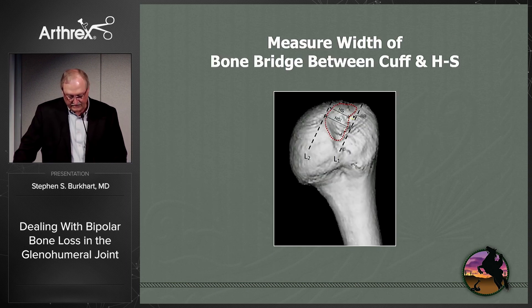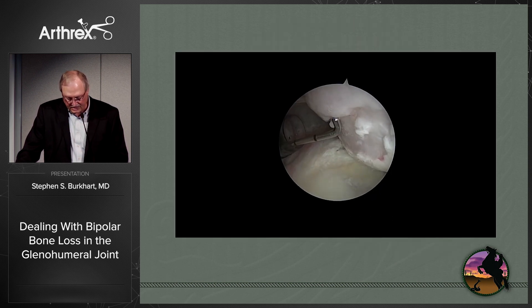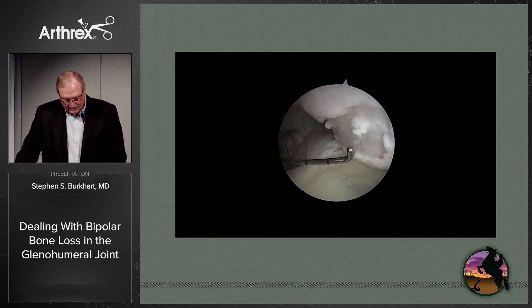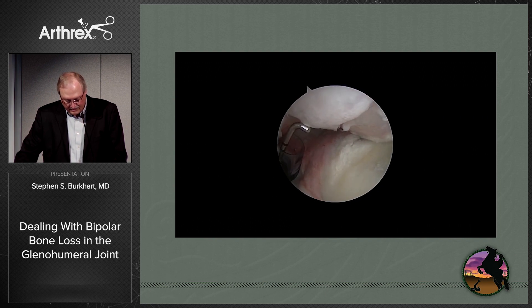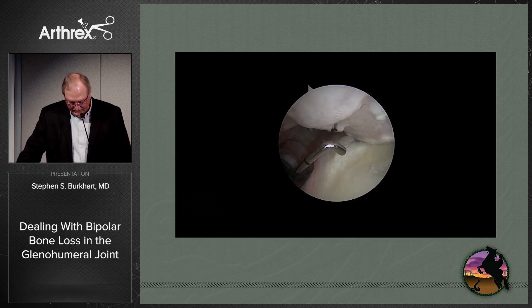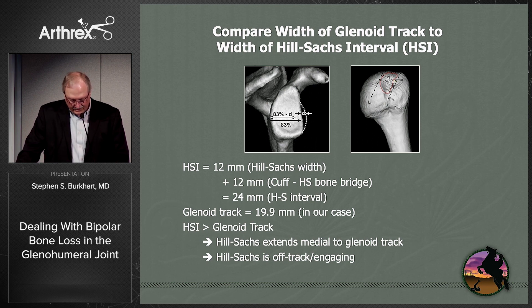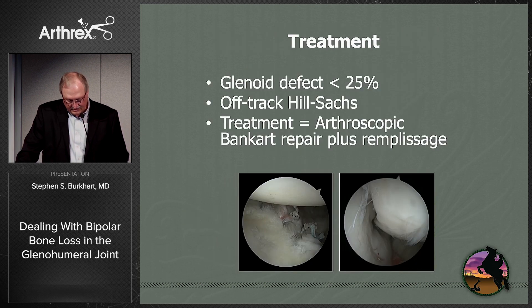You then measure the Hill-Sachs interval: first the width of the Hill-Sachs itself, then the bone bridge between the cuff and the Hill-Sachs, and add them together. Arthroscopically on this left shoulder from an anterosuperior portal, the end of the probe is four millimeters in length. We've got about three probe-lengths for the bone bridge and three for the Hill-Sachs — 12 millimeters for each — giving a total Hill-Sachs interval of 24 millimeters. Since 24 millimeters is greater than the glenoid tract of 19.9 millimeters, this is an off-track, engaging Hill-Sachs lesion. The treatment is therefore an arthroscopic Bankart repair plus remplissage.